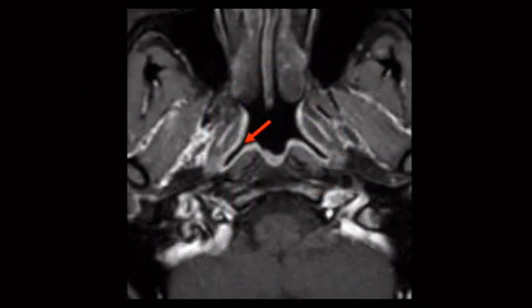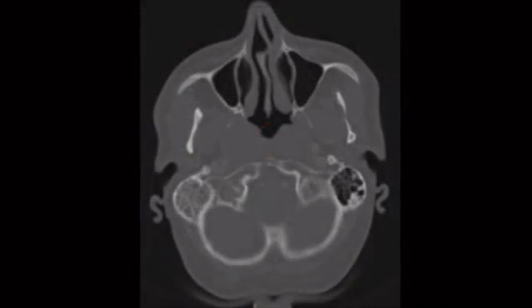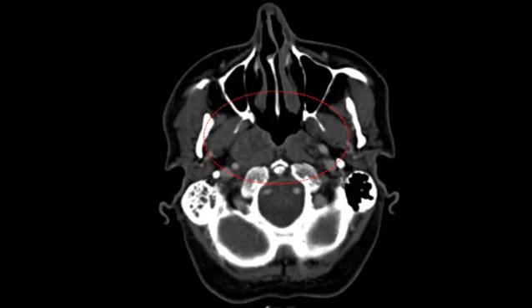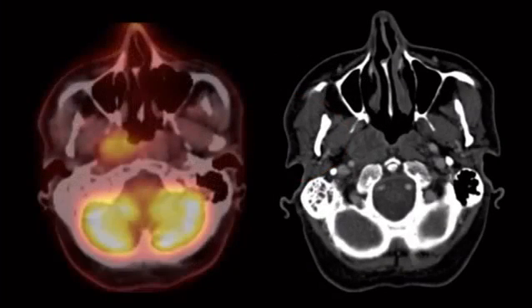Quick anatomy review: that right there is normal anatomy — the fossa of Rosenmuller. Here we've got a mastoid effusion, and it's unilateral. Anytime you see a unilateral mastoid effusion, you need to look at the fossa of Rosenmuller next, because a tumor there is going to obstruct the eustachian tube, which will result in a mastoid effusion.